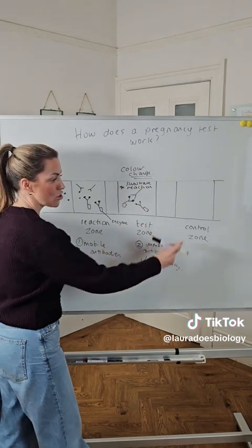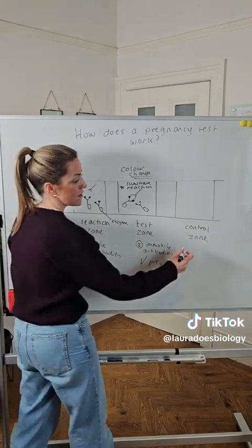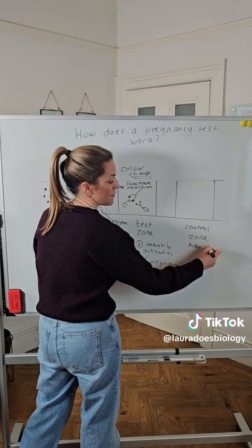Now, in the control zone, this is going to show us, has the test worked?